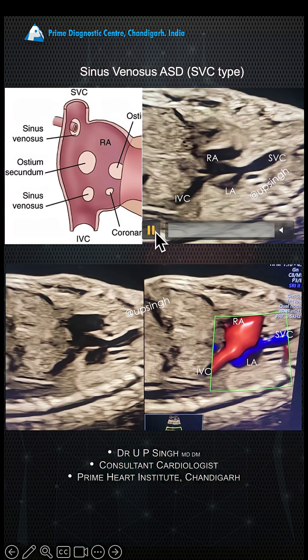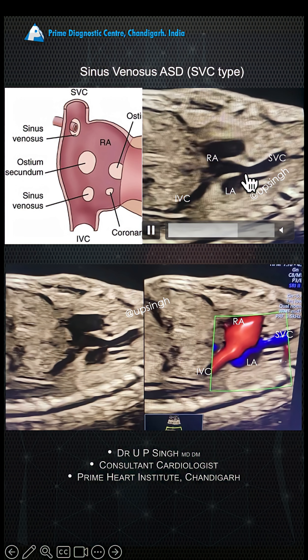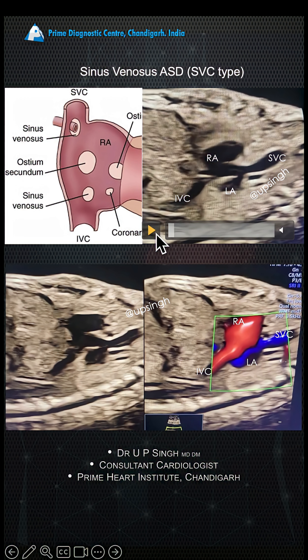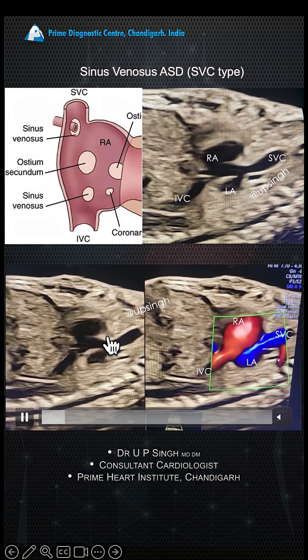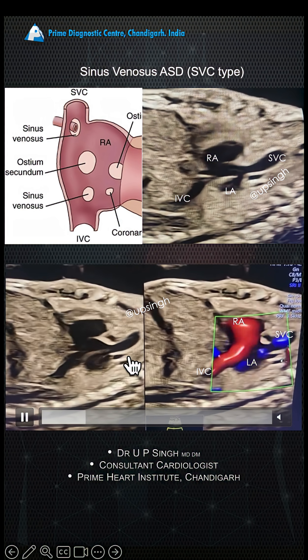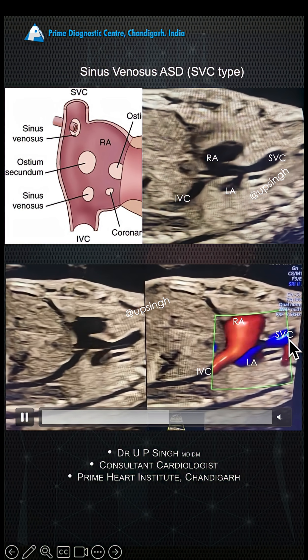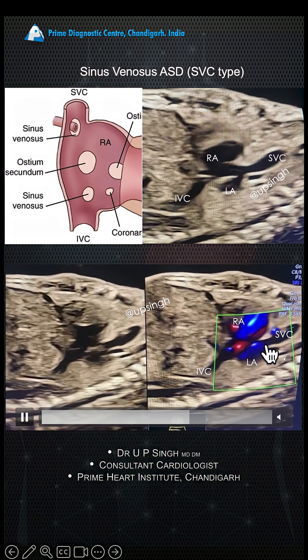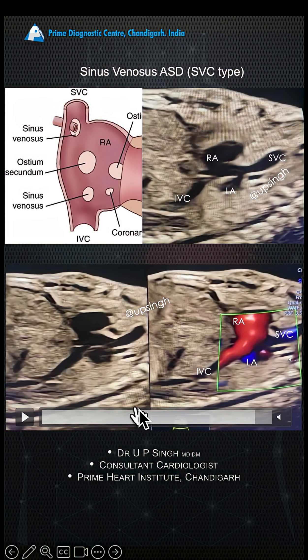How do you see that? You can see there is an override of the SVC. The overriding of the SVC with the defect on the interatrial septum is sinus venosus ASD. There is an override of the SVC, and you can see the blood from the SVC going into the right atrium as well.